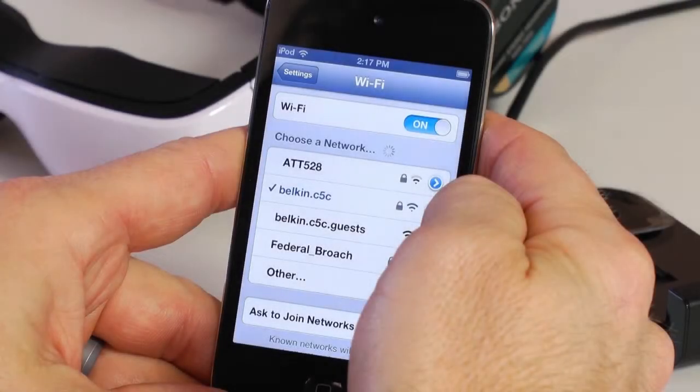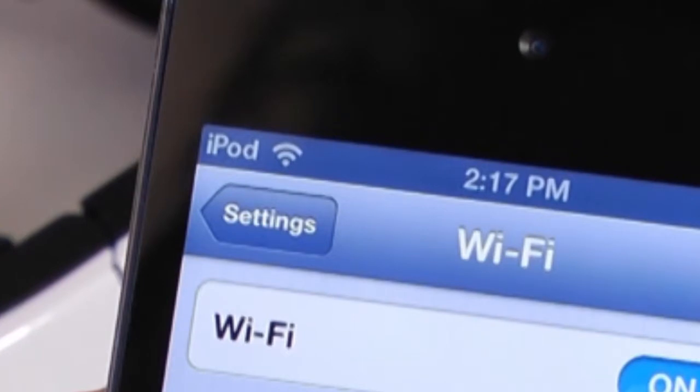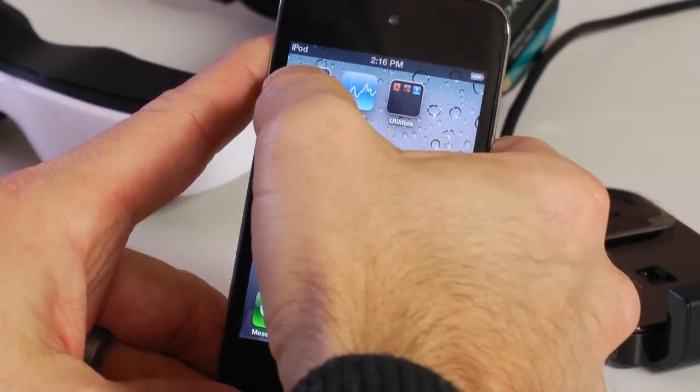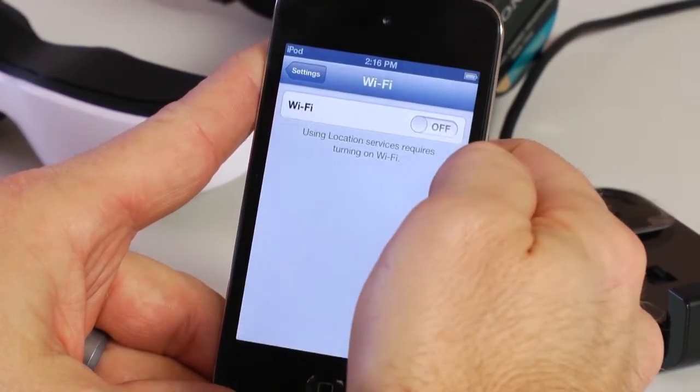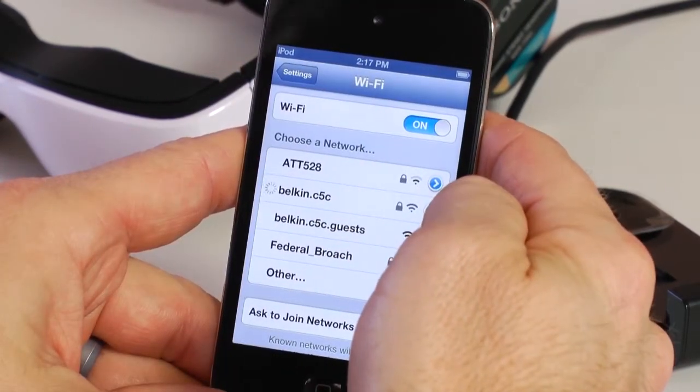The Cinema ProMed system comes with a 30-pin Apple adapter, which allows you to connect the Cinemizer to any compatible 4th generation or earlier Apple device. Connecting any Apple device to Wi-Fi is simple. First, make sure your Apple device is connected to the Internet by confirming the Wi-Fi icon is shown in the top left-hand corner of the device on the action bar. If the icon does not appear, select the Settings icon, then select Wi-Fi, sliding the bar to on. Select a network and enter a password if prompted.